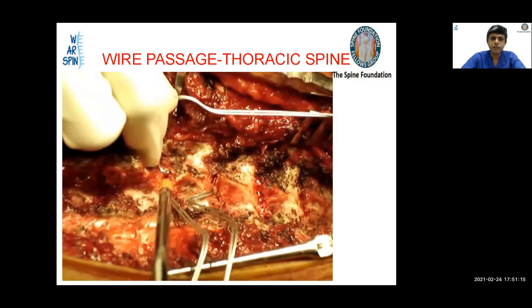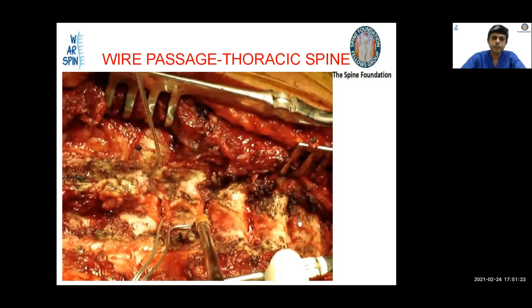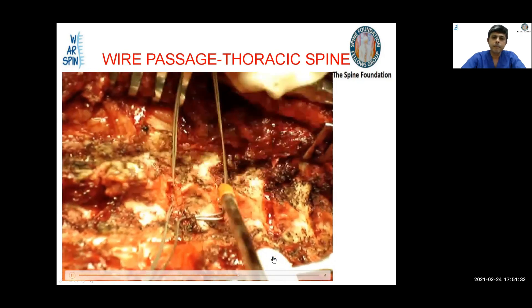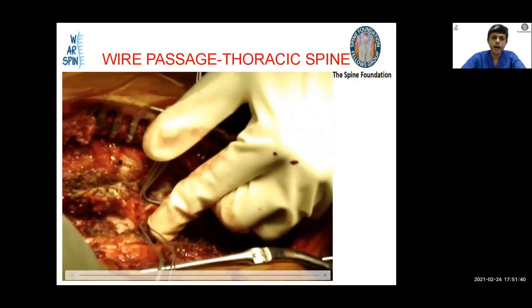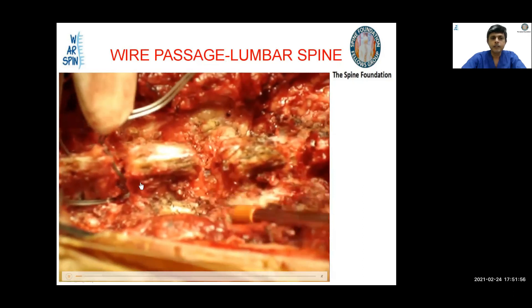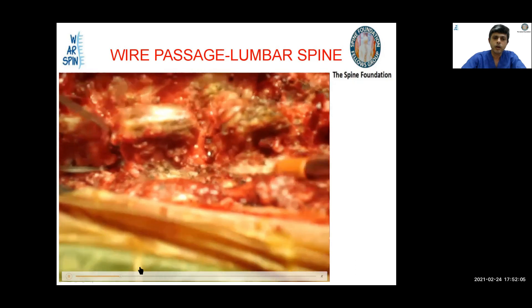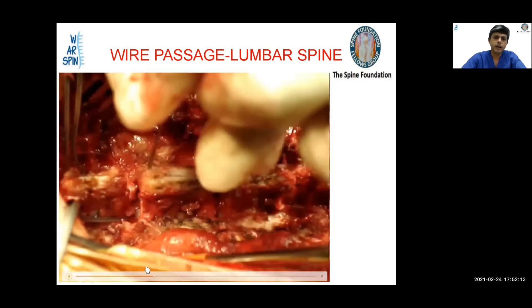From the prepared interlaminar space, you place the wire at one end and it scrapes under the lamina and pops out from the other side. You pick it up with a needle holder and pull it up. When doing this, you pull both sides of the wire simultaneously. This is the locking step — you pull the wire and lock it so that it doesn't impinge on the cord when putting multiple wires. Always go from below upwards, and lock it with your thumb over the lamina.